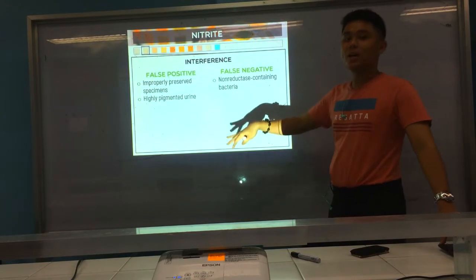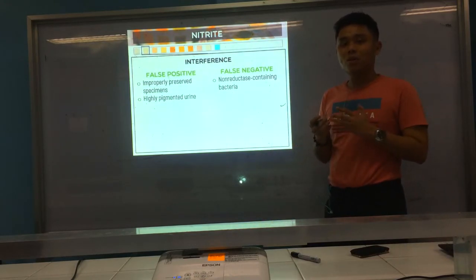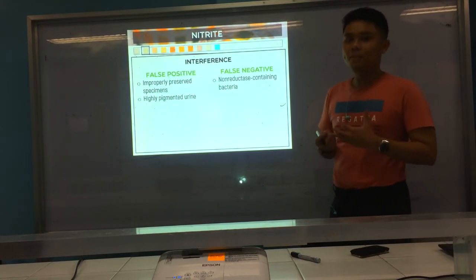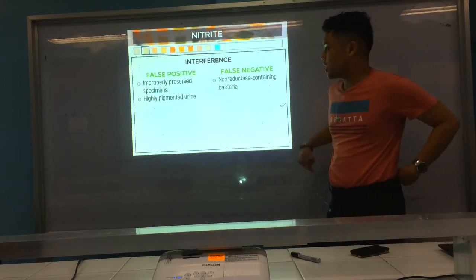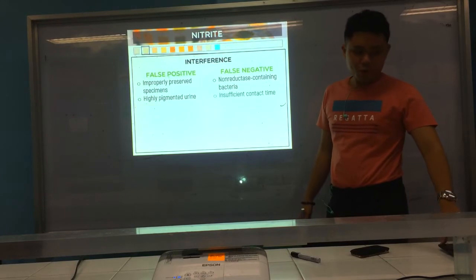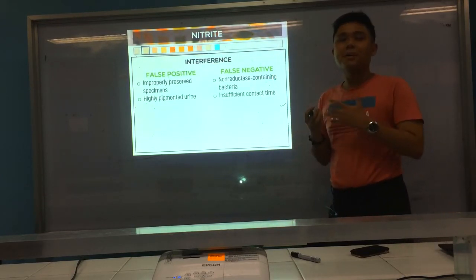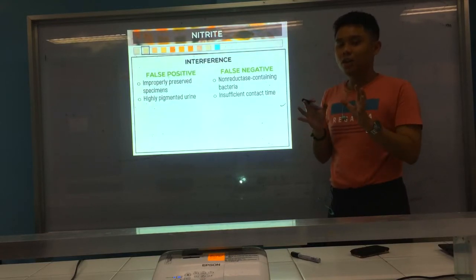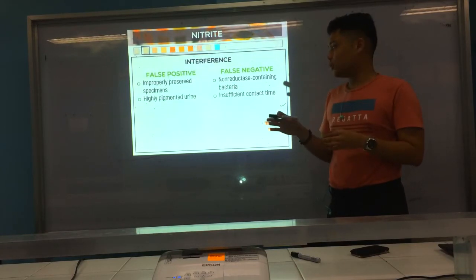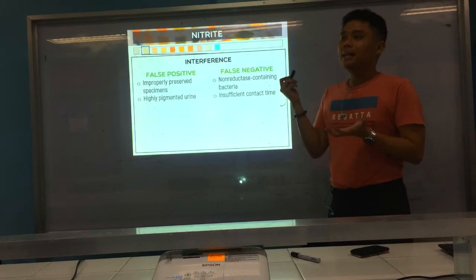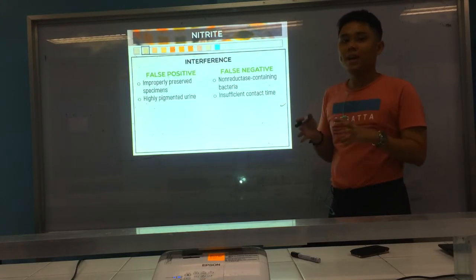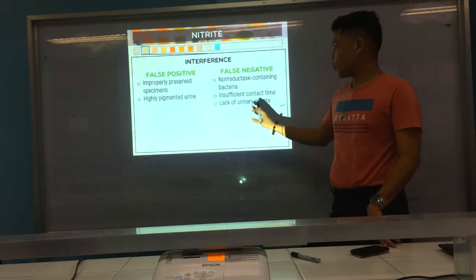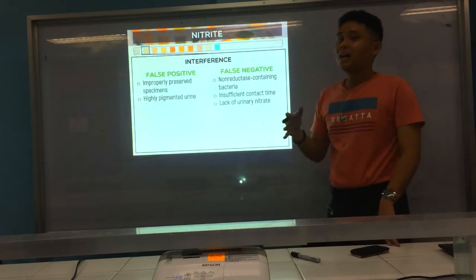For false negatives: first, non-reductase-containing bacteria — some bacteria that cause UTI, like Staphylococcus saprophyticus, do not have reductase enzyme, so the nitrite will be negative even though the patient has UTI. Second, insufficient contact time — there must be sufficient contact time for the bacteria to convert nitrate to nitrite. If tested too early, it may be false negative. Third, lack of urinary nitrate — if there is no nitrate, the bacteria have nothing to convert.